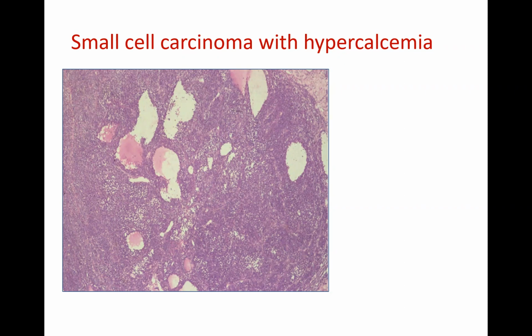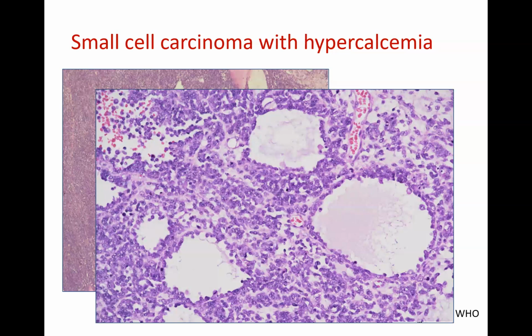Both tumors are in young patients. Both tumors are very cellular. Both tumors may have ascites, and both tumors may have holes. So how am I going to differentiate them? Again, remember, this is not going to be inhibin positive. This is a situation where inhibin stain could help you. And this tumor, as I said, unfortunately, the presentation is very, very classic, very aggressive, way more aggressive than juvenile granulosa cell tumor. You will be presented with this tumor, and the surgeon will tell you the patient is not doing very well, has ascites, and as I said, most patients don't even make it within a year.